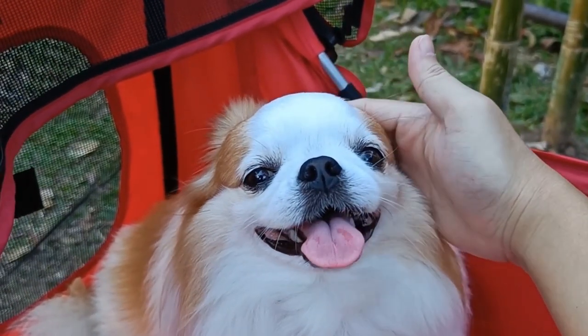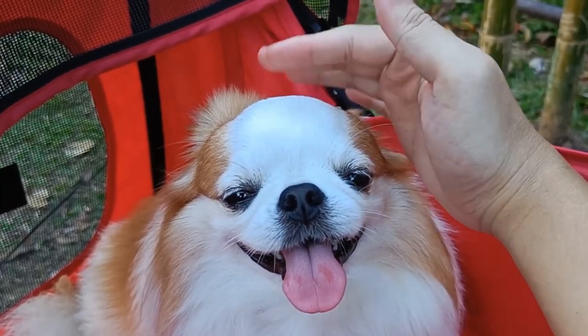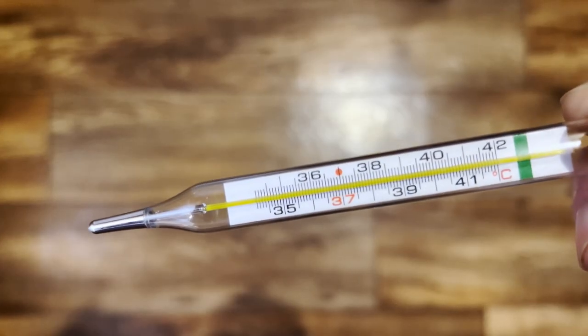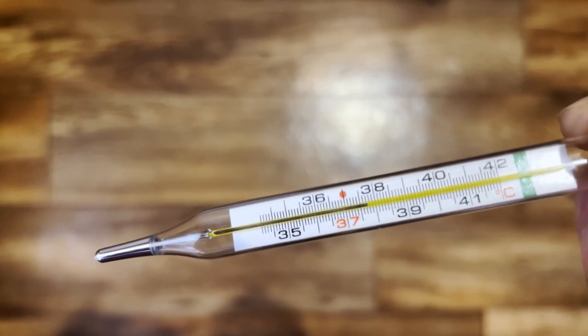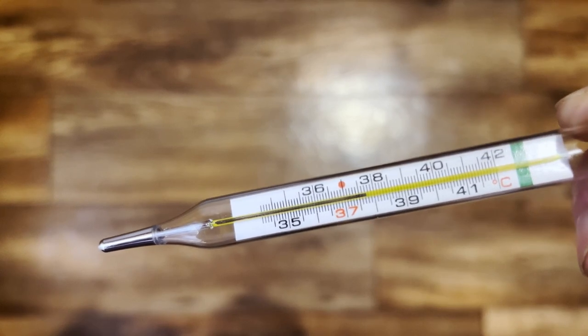Greetings! If you've ever wondered how to accurately measure your dog's temperature, you've come to the right place. To take a dog's temperature, you will need a thermometer specifically designed for veterinary use. Follow these steps to ensure an accurate and safe reading.